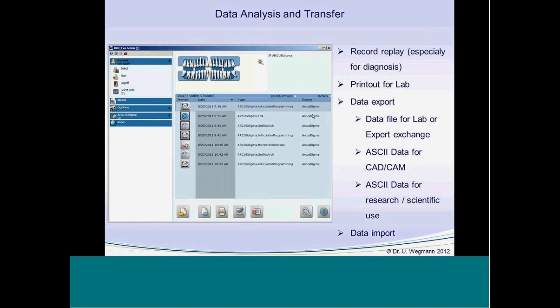And of course, I can send this data file to an expert to discuss this case with him to get some hints what to do in this case. Next step is that we can export this data as an ASCII file for the CAD/CAM machine to individualize the CAD/CAM design with functional movements.